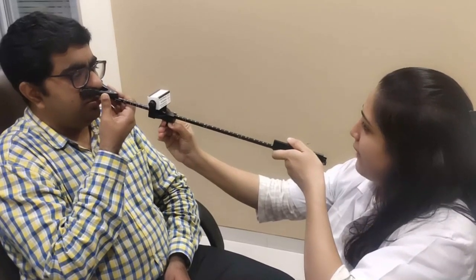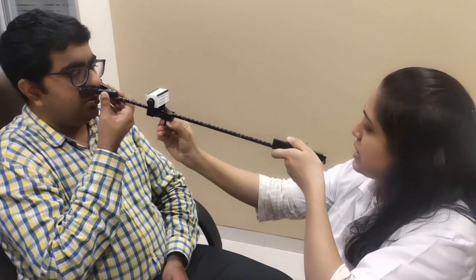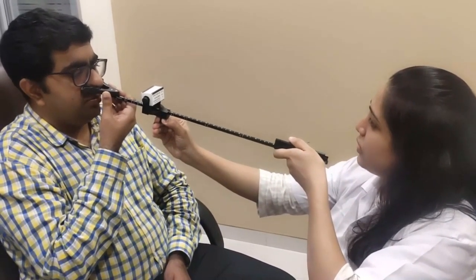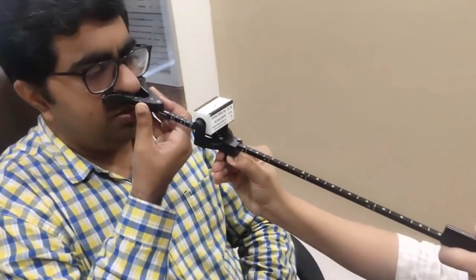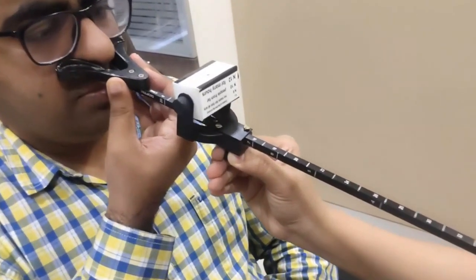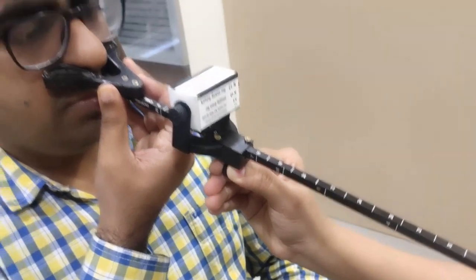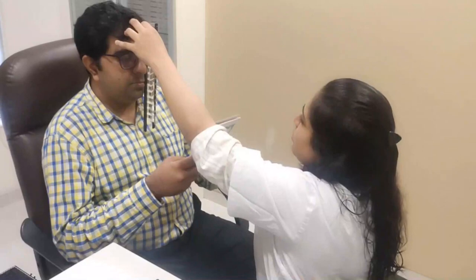Starts to get blurred. The last line, sorry, not the third line. Look at the third line, please. Okay, sorry. Clear? Now it's blurred. Blurred? Yeah. Close your eyes. Open. Blur still? No, clear. Now blur. Blur? Yeah. At 15 centimeters, the patient is seeing the letters blurred. That means the near point of accommodation is also receded.